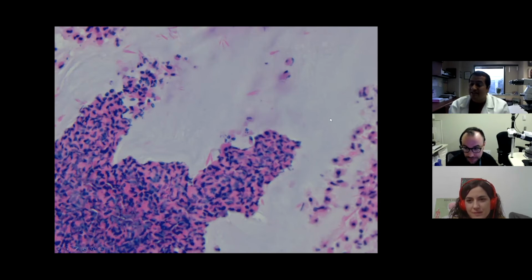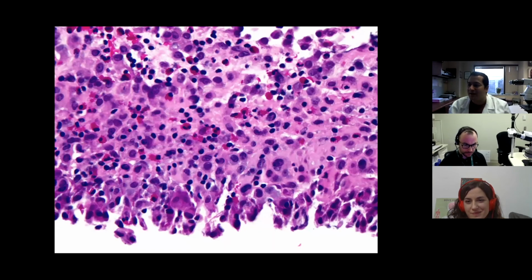So then this patient would have either mucoid impaction of bronchi alone or ABPA, and either way you should get a GMS stain to look for aspergillus and allied fungi like that. So really the main thing is the appearance of mucoid impaction of bronchi or allergic mucin. And this is a bit unfair too, because I didn't show the low mag where you would see the laminated kind of appearance. Okay, so non-spotter, sorry guys. Okay, let's go to another one.